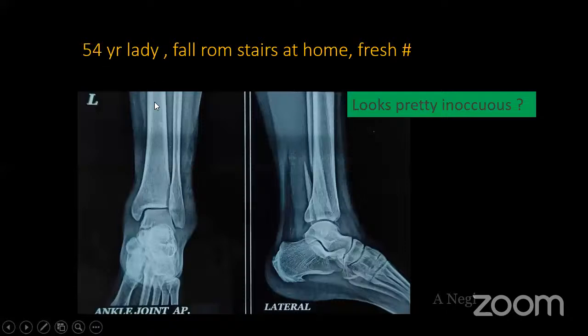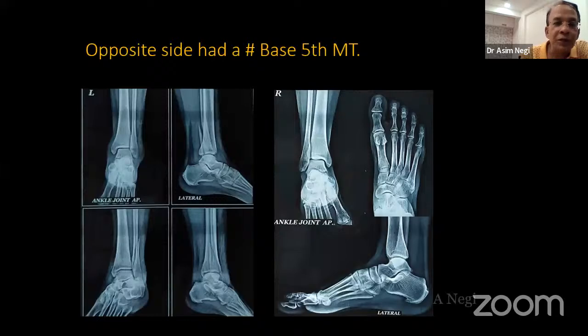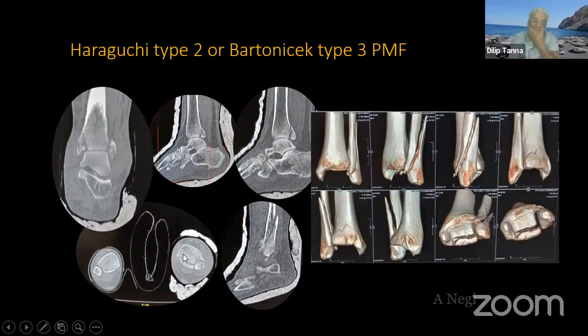This is the lady, 54 years old, fell down from stairs at home, fresh fracture. This is how she was. Looks routine, pretty innocuous fracture. Opposite side also had a fracture base, fifth metatarsal, which was conservatively treated. This is her CT. If you look at the CT closely, in axial view, it's Haraguchi type 2 or Bartonicek-Rammelt type 3, where the posterior malleolar fracture is going right across almost to the medial border.